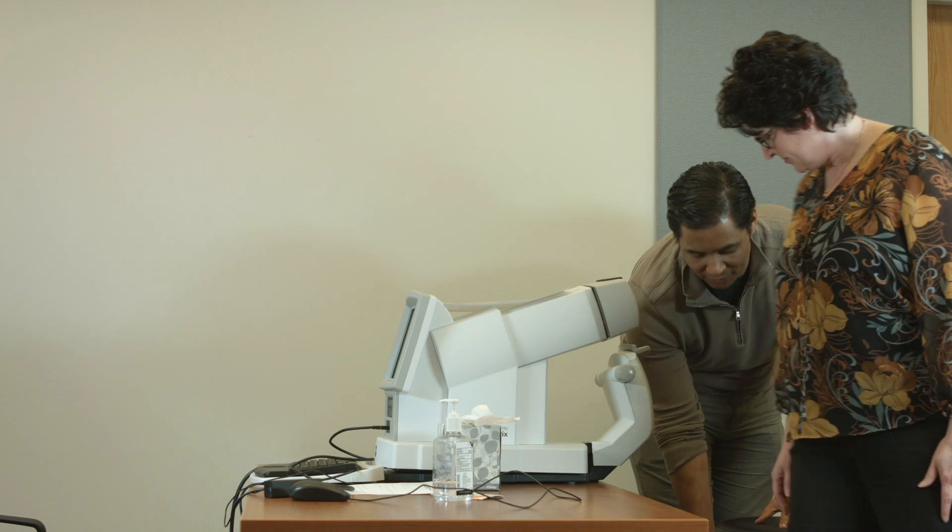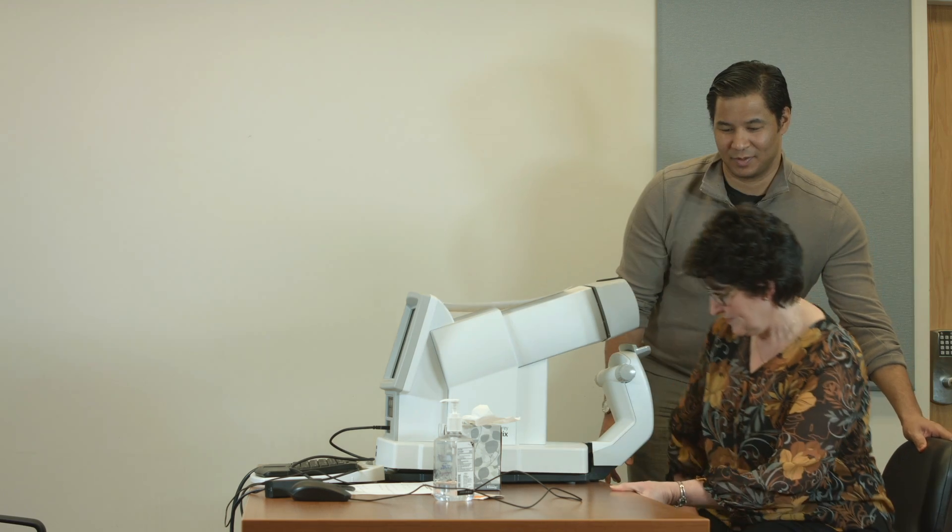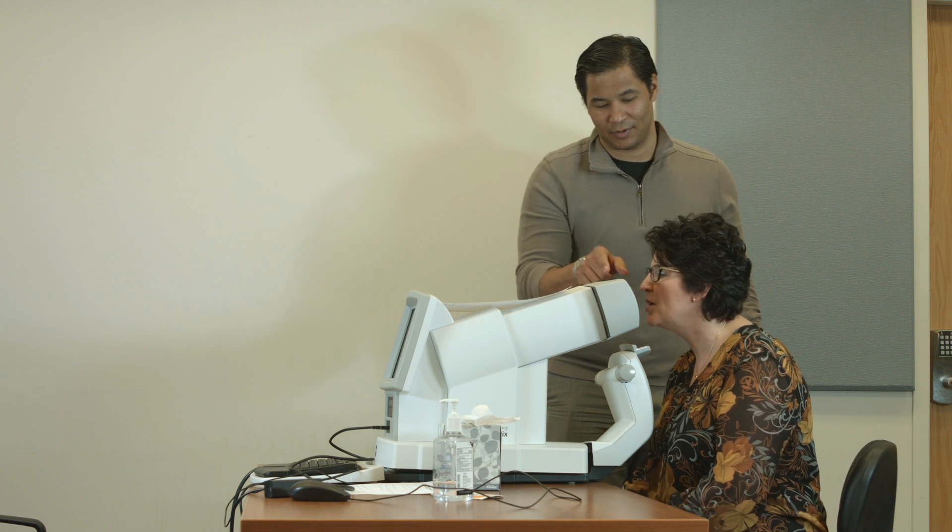Issue 3: Chair is too high or too low. Adjust the chair. The test is long, so make sure the patient is comfortable in their spot.